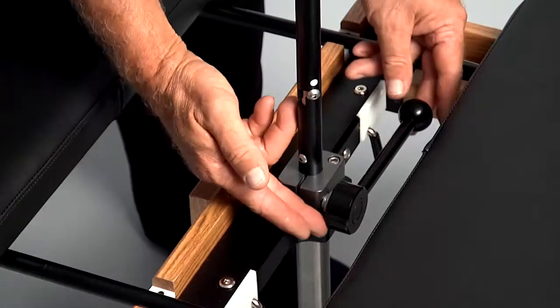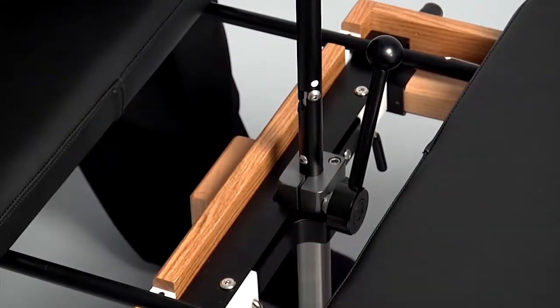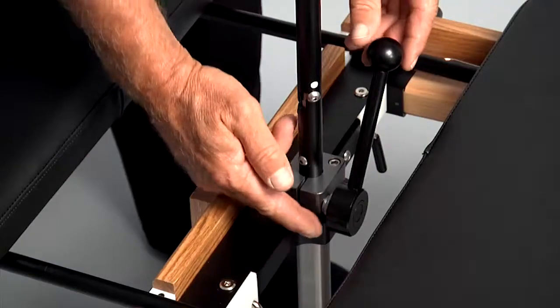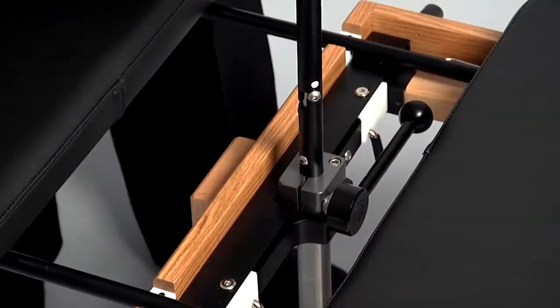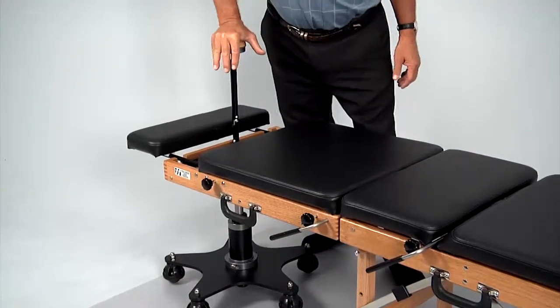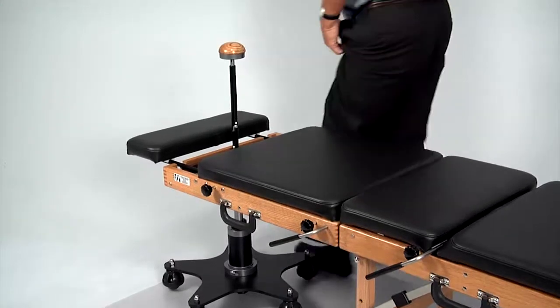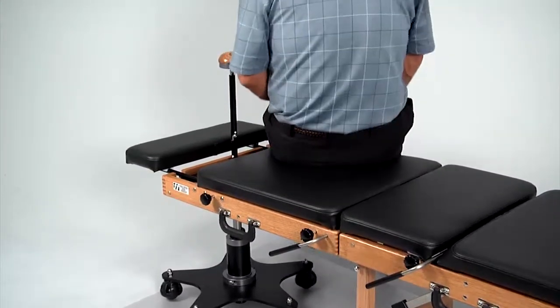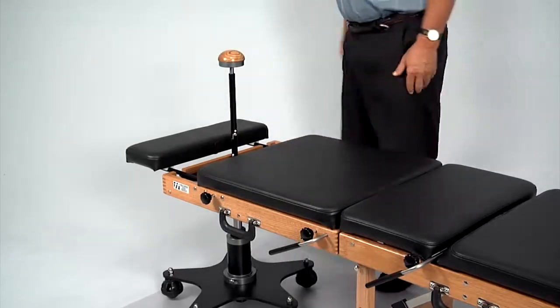The portable table with flexion distraction is now ready to use. When the position indicator button is in the white position, the flexion distraction mechanism is locked into a fixed position, allowing a patient to safely sit on the table.